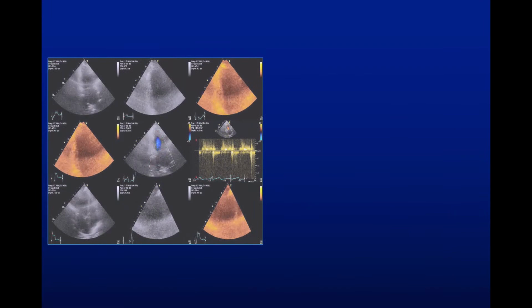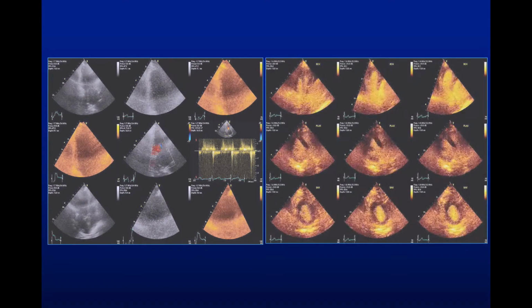Usually I like to show this case because in a regular audience we would poll them and see what the ventricular function is, is this normal or abnormal, and the audience is usually split, and you can make your decision whether the heart is functioning normally, and this is your answer. And the same patient using ultrasound enhancing agents, take a look at that. Ventricular function is very nice and normal. The pictures early on are deceiving, and you really should not interpret that.